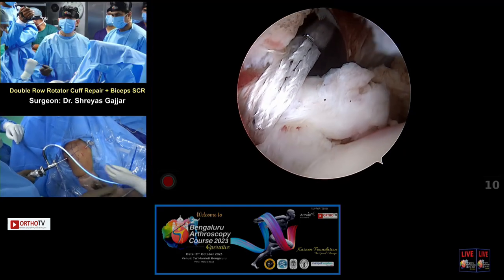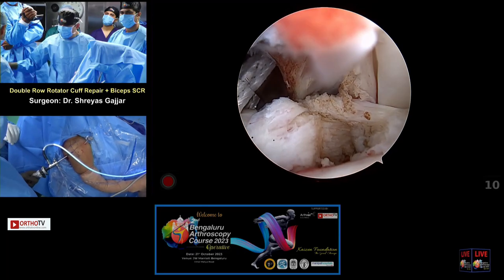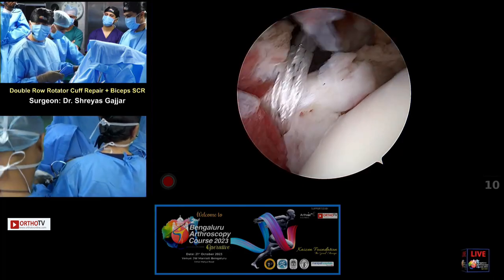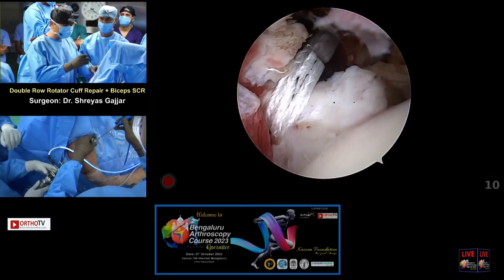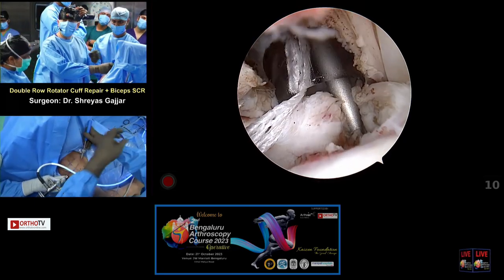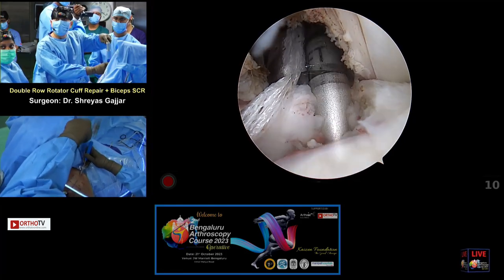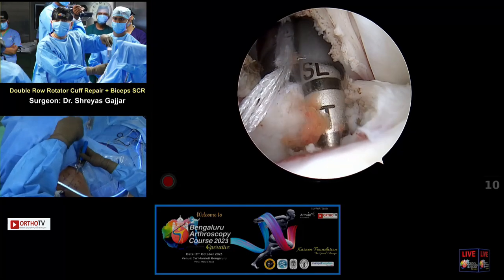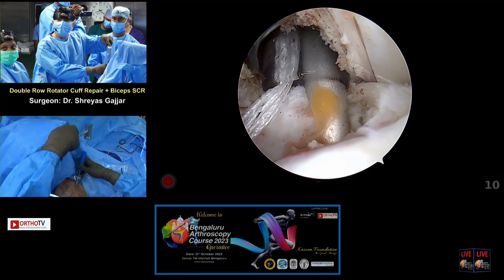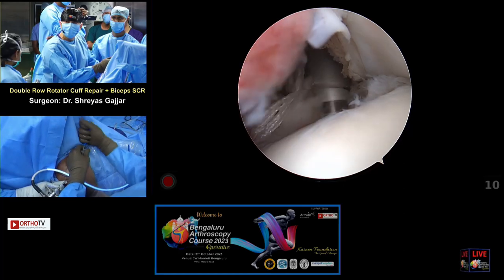So I've just passed the tape. I use a bird beak to pass the tape. It's important to clear the rotator interval to ensure proper suture management. So we've passed that. Now I'm going to use a 4.75 BioSwiveLock anchor. We have prepared the bony bed for the reattachment, and we have a dedicated tap for it. As you can see, the first one is for the BioComposite screw, and the second one is for the SwiveLock. One should ensure that the SL marking is buried inside. So we've done that.